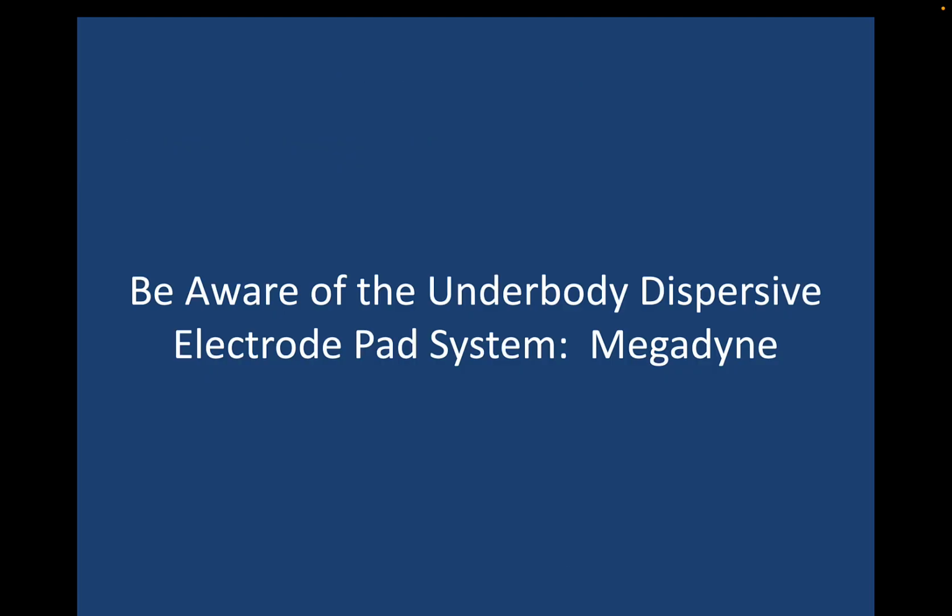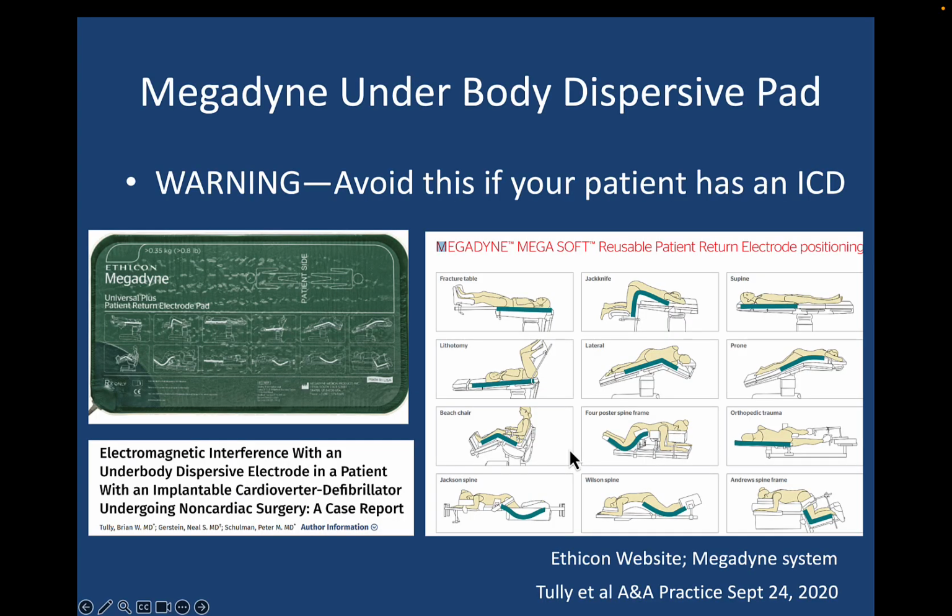The other thing to think about is to be aware of the underbody dispersive electrode system. Now, I don't know if you use the Megadyne here, but it's being used more and more. It incorporates the Bovie return pad into this pad that the patient lies on.